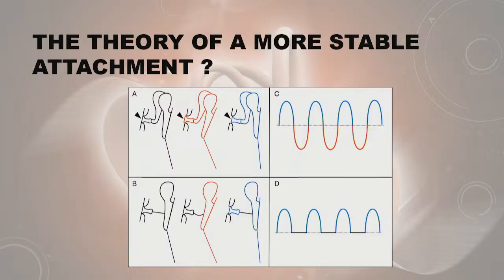So one concept that made me change to cement was the idea of not only stability of the prosthesis, but it never made sense to me, if we put a TORP or something, what's attaching it to the footplate? And we know that there's that bimodal movement of the footplate that might give you that increased hearing.